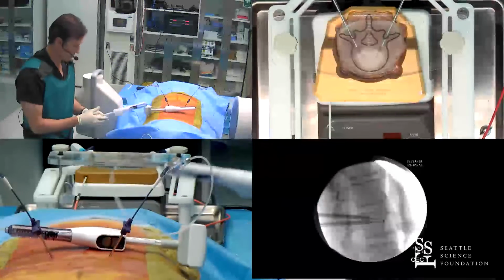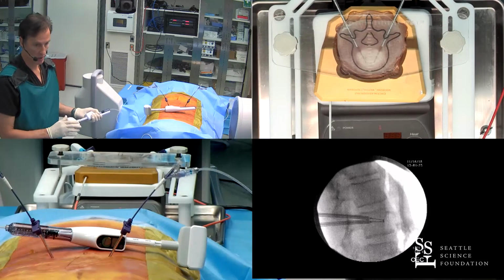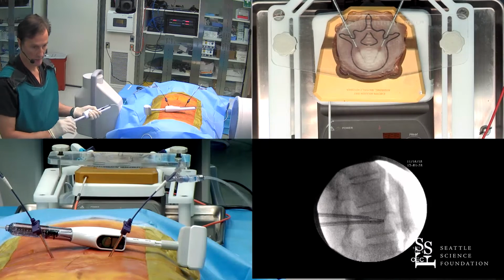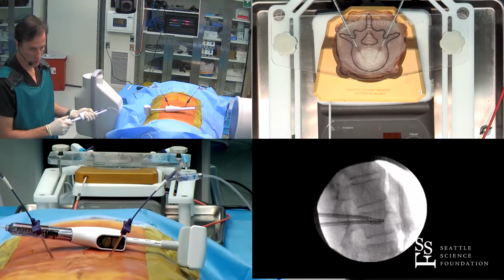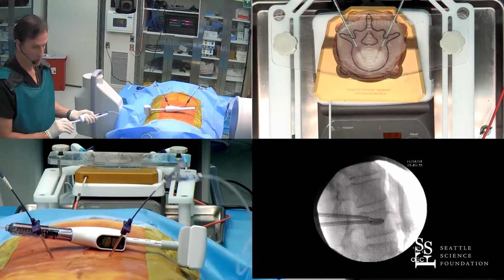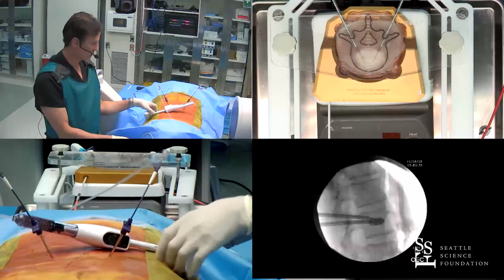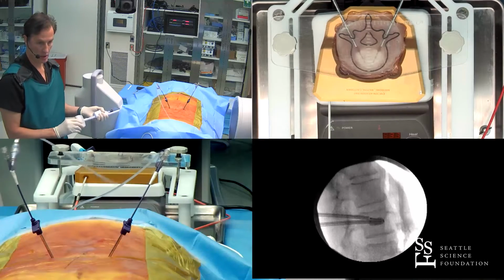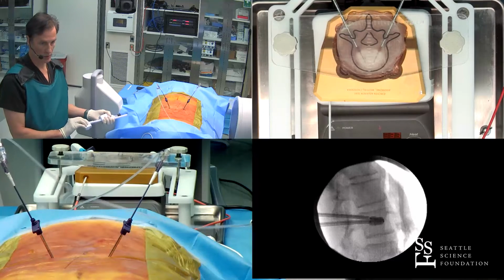So we will inflate the balloons, keeping an eye on not only visual, but also pressure. These are Expander 2 balloons. They're pressure rated to 700 PSI. Low compliance, they're made of nylon. These will routinely go up to 1,000 PSI. So if you want to really test them, you absolutely can.